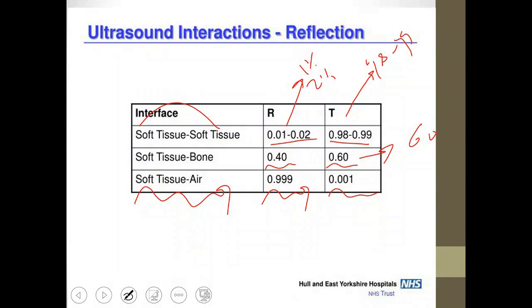That's why, for example, when you use a transducer on a patient's body, you apply gel. Why do we use this gel? To reduce the impedance mismatch between the crystal itself and the air, because there is air present here. This air can cause significant reflection, which prevents the beam from penetrating and entering the soft tissue. Therefore the presence of this gel reduces the impedance mismatch, which is very important.